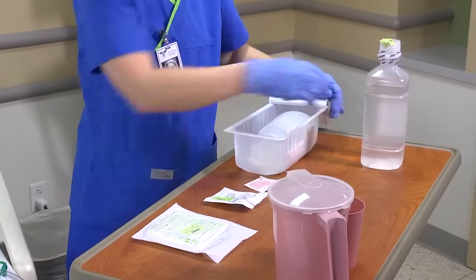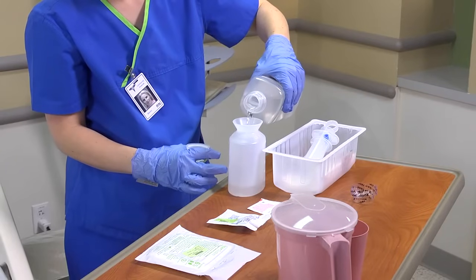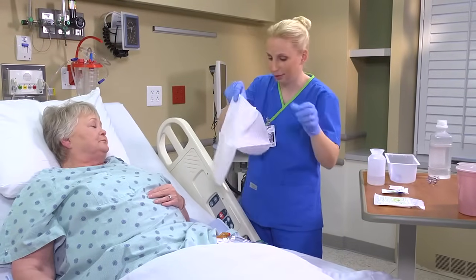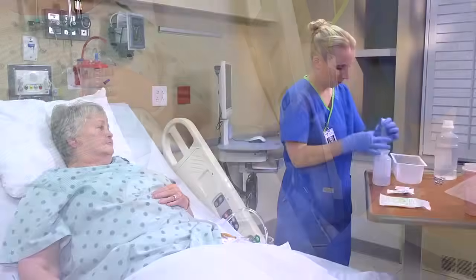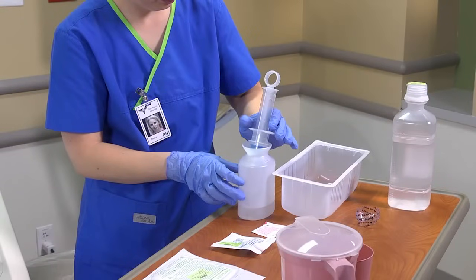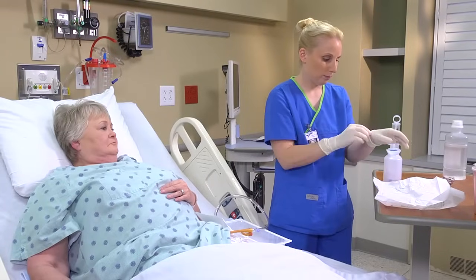Open the sterile irrigation tray. Pour the required amount of sterile solution into the sterile container and replace the cap on the solution bottle. Slip a sterile drape under the patient's catheter. Aspirate the prescribed volume of irrigating solution, usually 30 milliliters, into the syringe. Rest the syringe in the sterile solution container until you're ready to use it. Move the sterile collection basin close to the patient's thighs. Apply sterile gloves if required by agency policy.